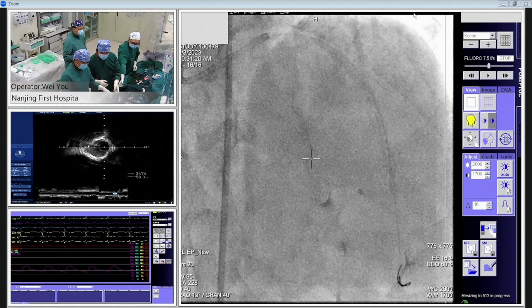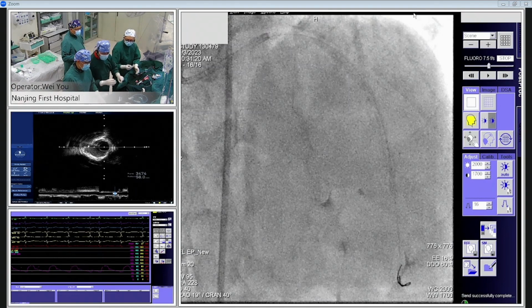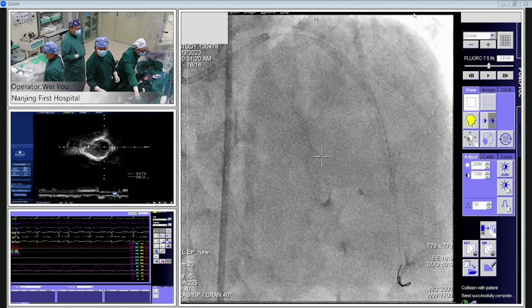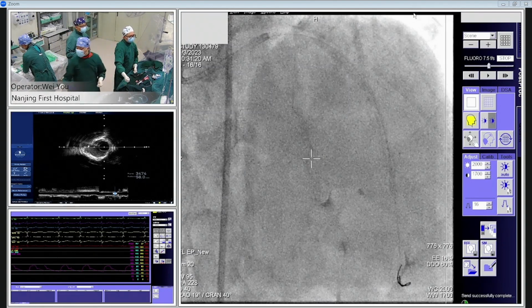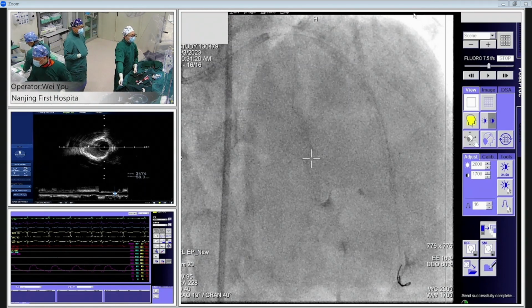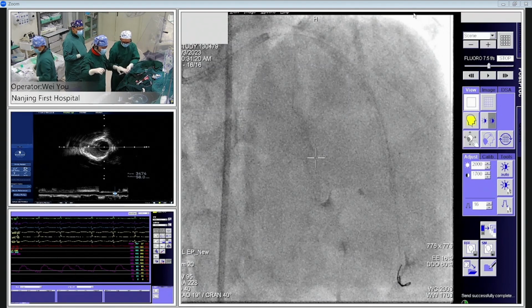2.5. No, it's not. And prepare the 3.0 and the 3.5 balloon. It's not NC. It's Quantum. Give me a 2.5 NC balloon. NC. New one. 2.5. NC. Okay, Quantum.